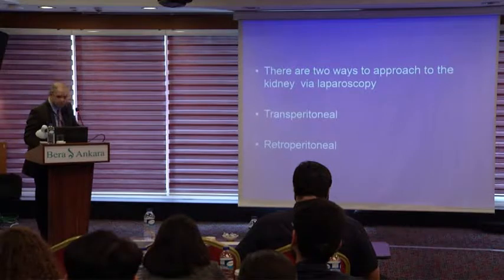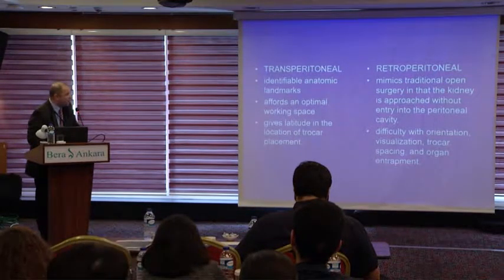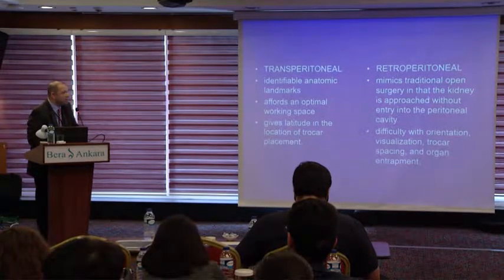Both ways have some advantages and disadvantages. In the transperitoneal way, you have identifiable anatomic landmarks and enough space to work in, but you open the peritoneal cavity. In the retroperitoneal way, urologists are familiar with this approach. It mimics traditional open surgery.